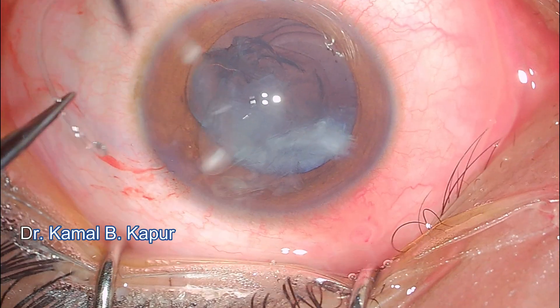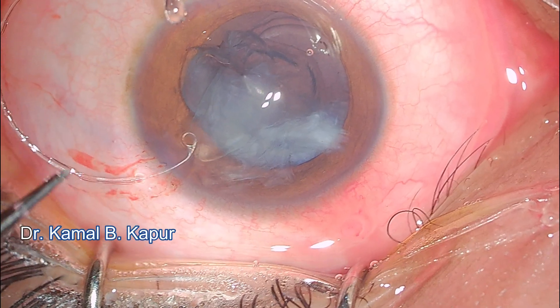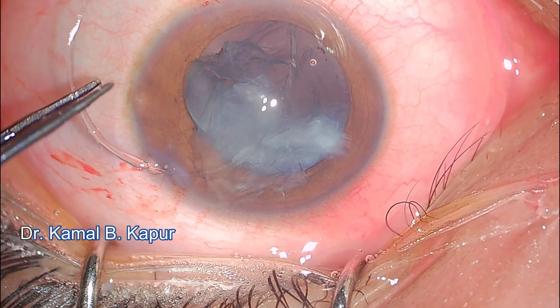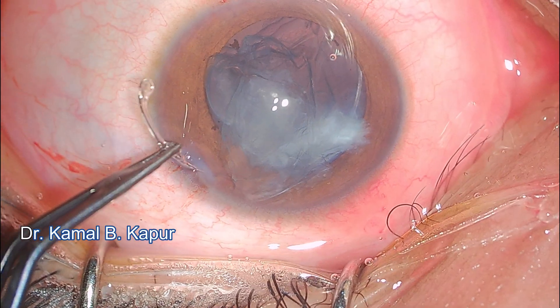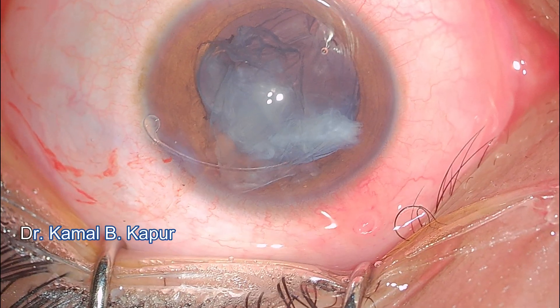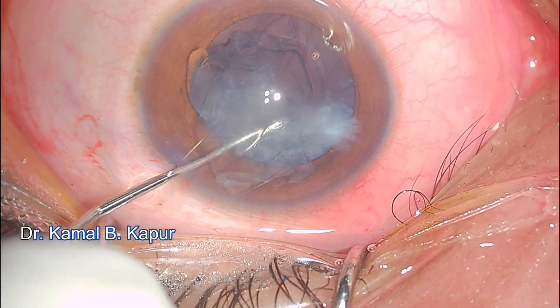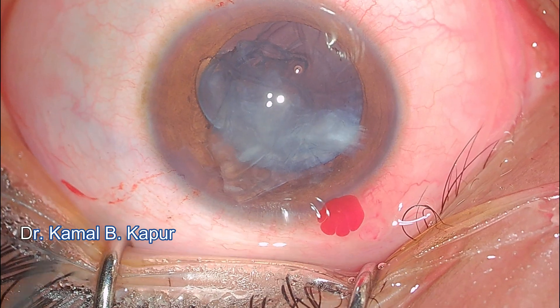Now we insert the capsular tension ring (CTR). The trick is always to go in from the area of least subluxation and proceed in a dialing manner with tangential vector forces, then cross the area of subluxation. The pushing forces are tangential and circular, and as the CTR goes in it pushes back the subluxated area. I engage the eyelet of the CTR with the Sinski hook, push it downwards with a dialing movement, then tilt the Sinski hook to release the CTR. The bag is now secured.